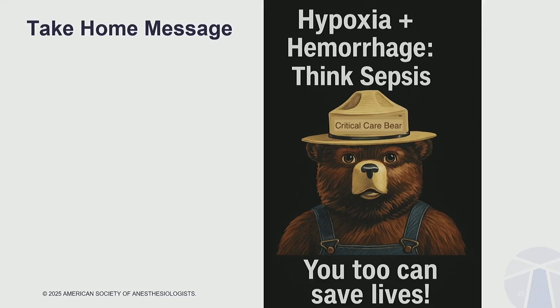The first topic on the cardiac focus exam, in terms of the diastology, based on the echo guidelines, they actually recommend against doing that in a patient who is anesthetized under general anesthesia because it drastically changed the loading condition. And I would also argue this is probably not to be done in a patient who is actively receiving neuraxial anesthesia for the same reason. So I think if you want to study that in a particular patient, you should do it before you anesthetize them for any reason.